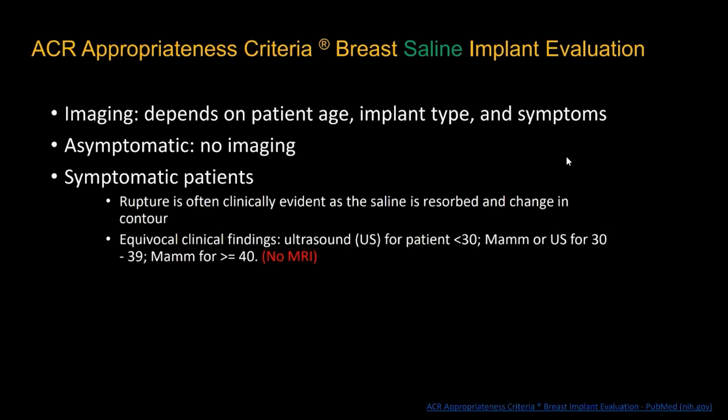So in this slide, we are going to talk about the ACR recommendation for evaluation of breast saline implant integrity. It depends on the patient's age, implant type, and symptoms. If a patient has no symptoms, there is no imaging screening recommended by the ACR. However, if a patient presents with symptoms, we recommend different initial imaging evaluation based on patient's age, but no MRI for those patients.